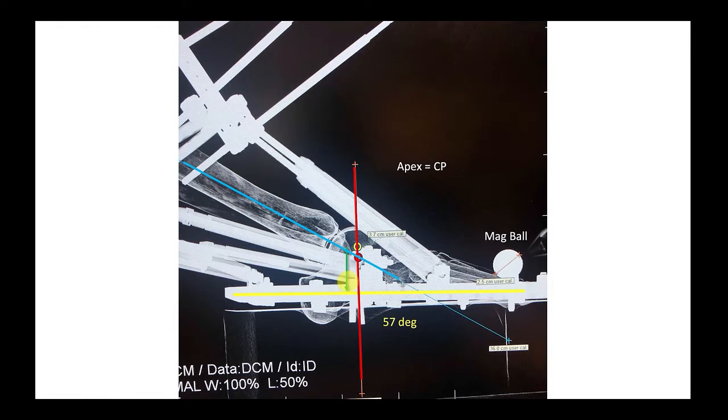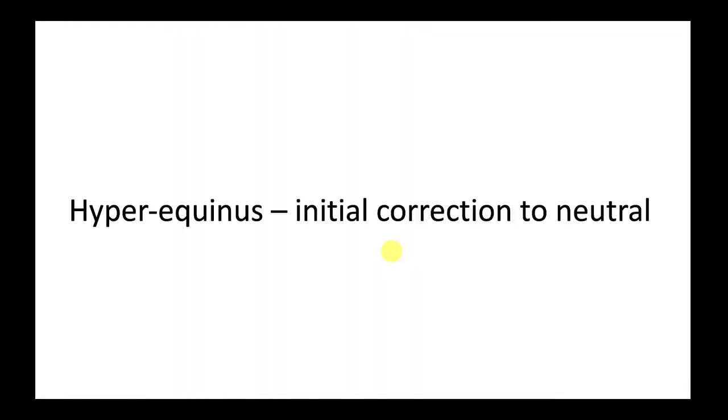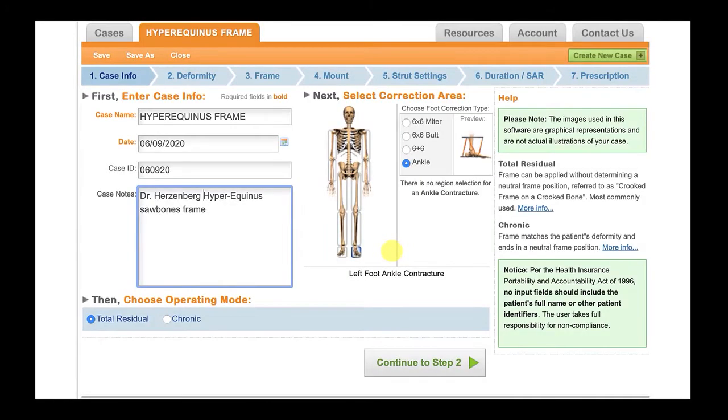Now, all the measurements are made relative to the mag ball. You can see just above the toes there's a 2.54 centimeter mag ball, 1 inch mag ball. So our measurements can be quite accurate. So now let's take these measurements and go to the program and do our initial correction to bring this from hyperequinus to neutral. This is the first of 7 screens that we'll have to deal with.